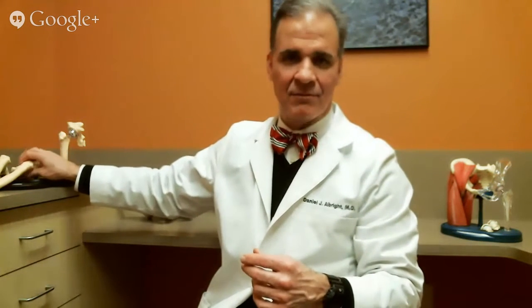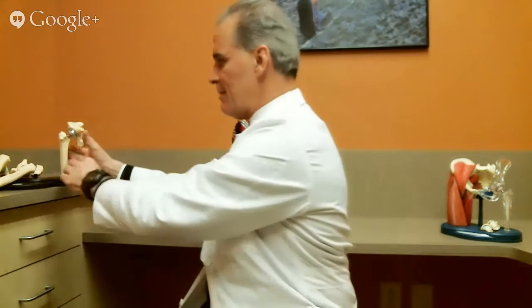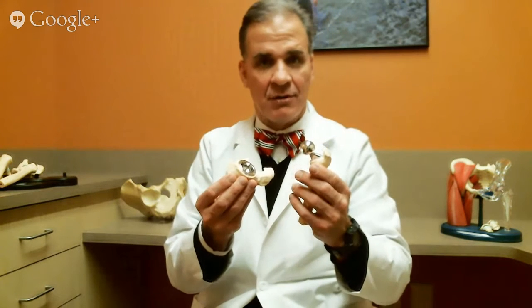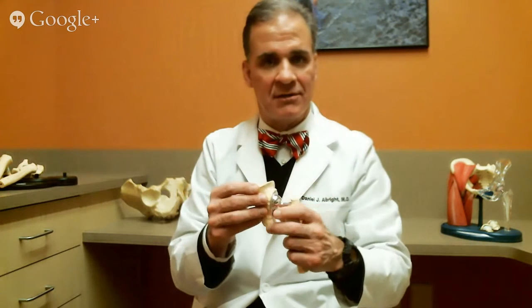And that's what a worn out hip looks like. When you can't walk anymore, you do an artificial ball and socket — very smooth materials on smooth materials that reproduces nature to a degree. And it works. The science is there and the research is there.